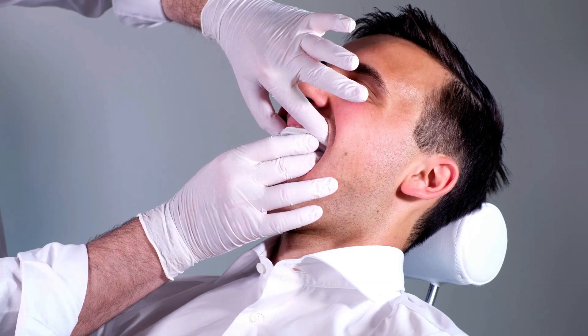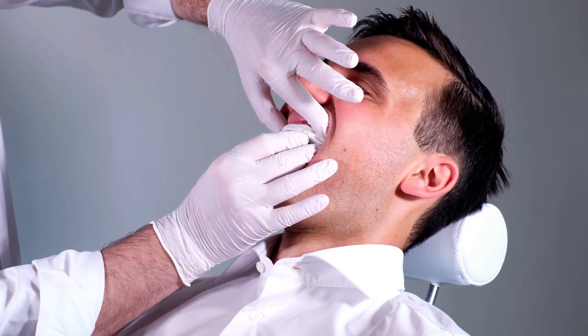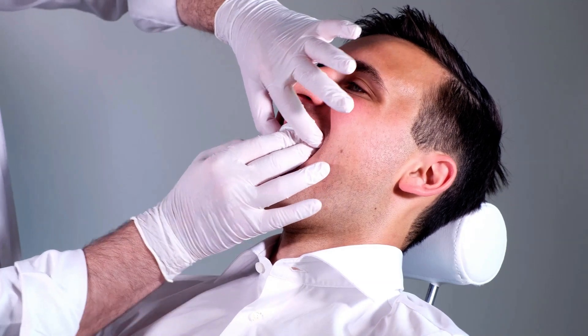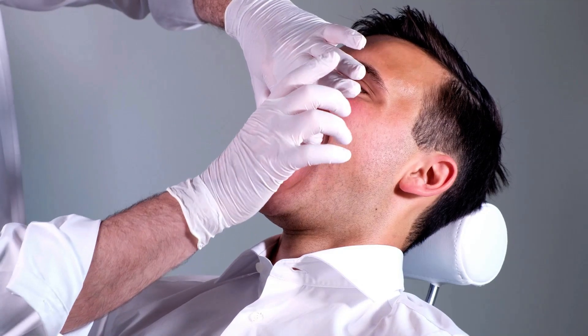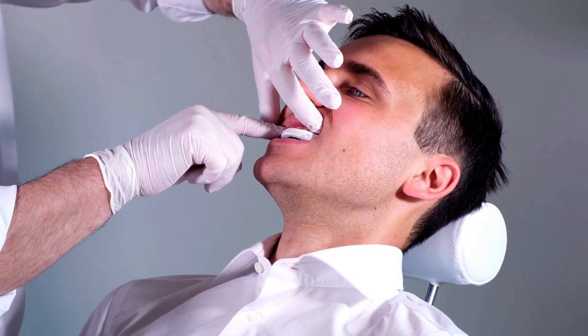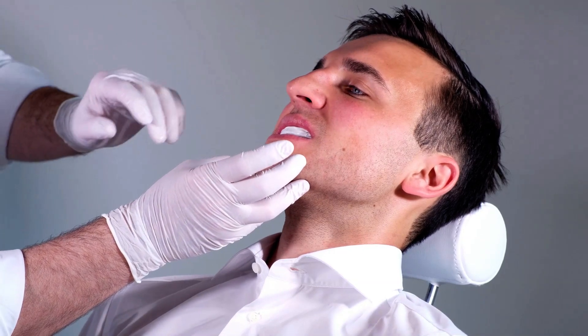If the tray doesn't match the dental arch, the width can be altered by gently pulling the fixation knobs apart or pressing them together. Press the bottom of the tray from the front to the rear against the upper teeth using your thumbs and forefingers. Keep the tray in place and gently press the thermoplastic material with your fingers at the outer and inner wall of the tray against the teeth.